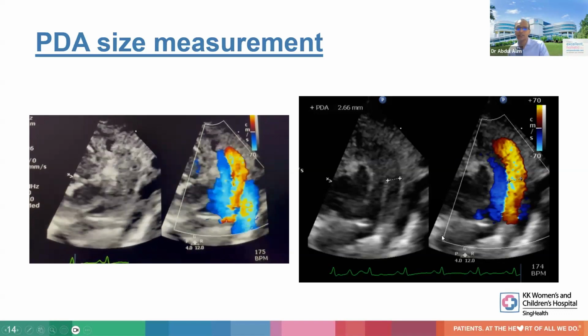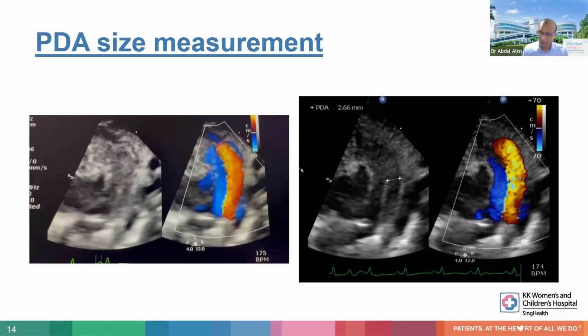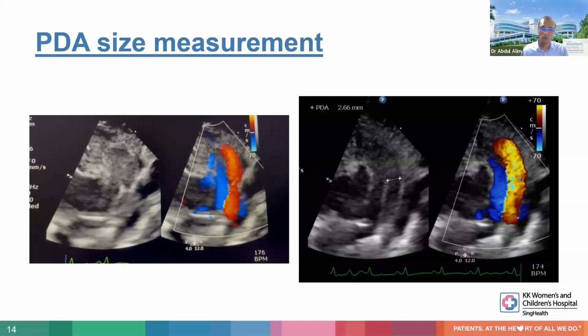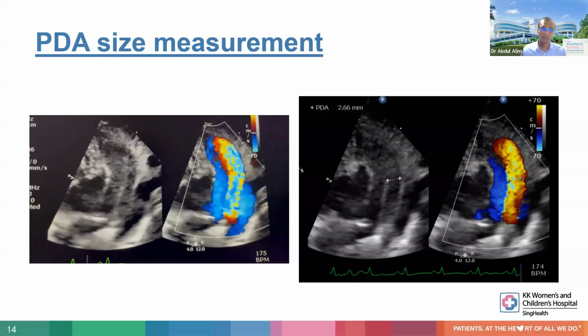This is a good example of a nice PDA, but sometimes it may be technically challenging, especially if the baby is on a ventilator, the baby has RDS, and the lungs are slightly overinflated. We may not be able to get a very good view like this.